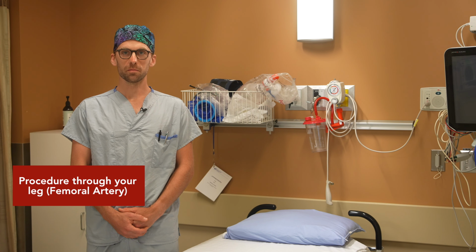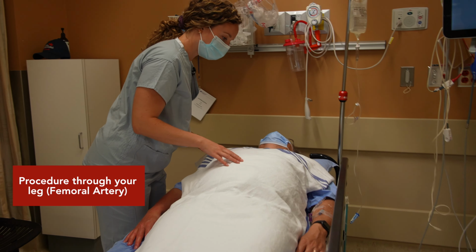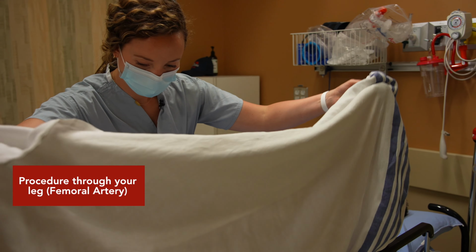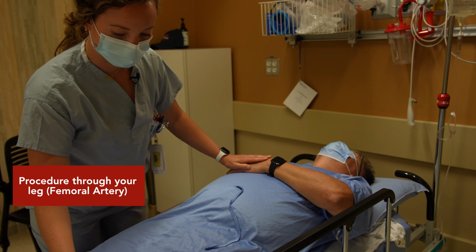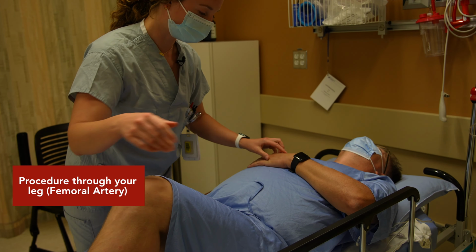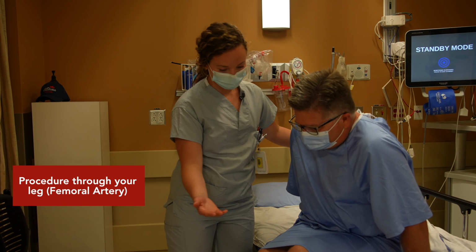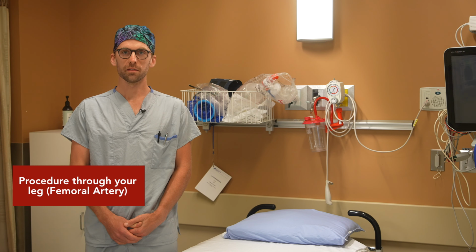This will be decided based on medications you have received during the procedure, and it does not change the recovery course. Once the staff is confident you have no bleeding, you will lie flat on your back with your legs straight for approximately 2 hours. If you have trouble lying flat, let the nurses know, as we can help make you more comfortable during this time. After 2 hours, the nurses will teach you specific ways to get out of bed, sit in a chair, and walk to reduce your risk of bleeding. The nurses will continue to monitor you for bleeding until your support person comes to pick you up. When your support person arrives, the nurses will teach them how to help you if you have a bleeding emergency after you are discharged.